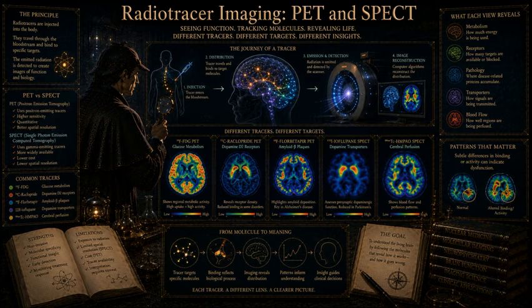That sounds absolutely horrific. If I am trying to run a study on volunteers with severe generalized anxiety disorder or paranoid schizophrenia, there is no way they are tolerating an arterial blood draw for 2 hours. You are entirely correct. It is highly invasive, painful, technically excruciating, and incredibly stressful for the patient. It severely limits the kind of research you can do, which is why the development of reference tissue models in the 1990s was an absolute paradigm shift for psychiatric neuroimaging.